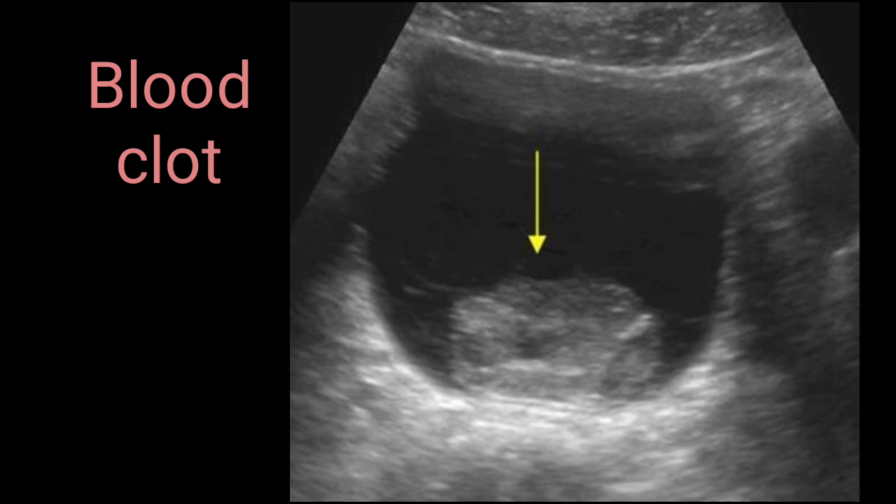Always ask the patient for previous records, always take the history, always ask about the urine color, and look if any urinary test report is available to you, any previous urinary infection or kidney infection. Especially if the patient is older, look for any instrumentation or previous urinary retention. There will be catheterization, especially in post catheterization cases. There is always a blood clot within the urinary bladder.